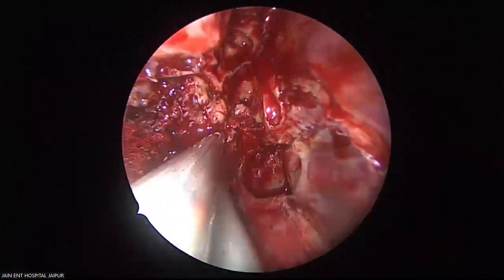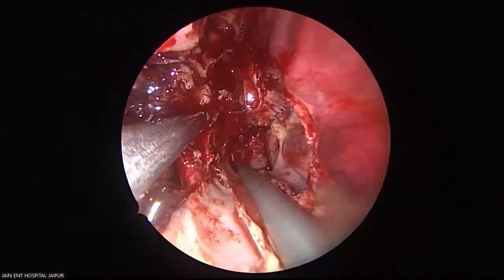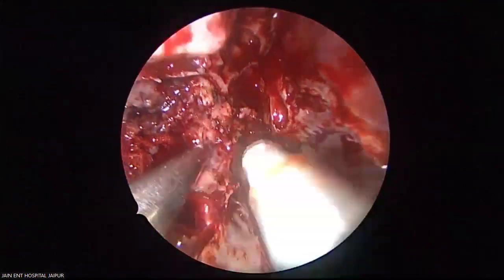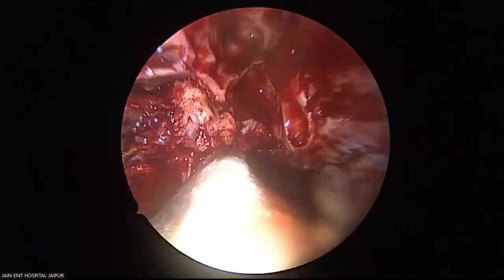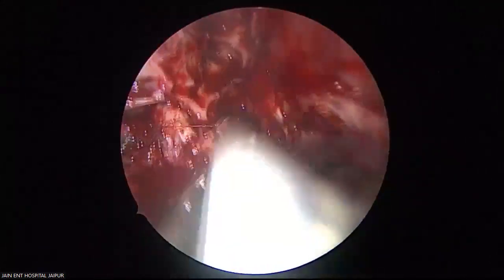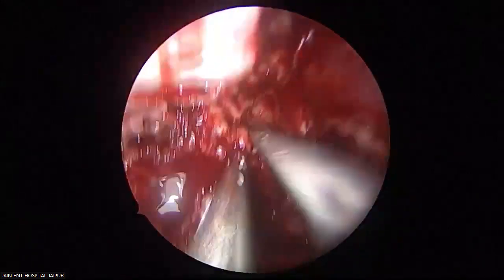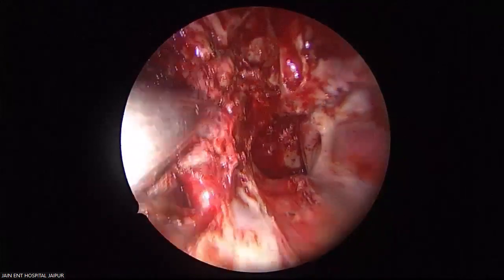Now the tumor is left over in the pterygoid process, pterygoid fossa, this is going to the inferior orbital fissure. See there up. This is superior orbital fissure and posteriorly it continues with the cavernous sinus. So one by one we will remove this thoroughly.